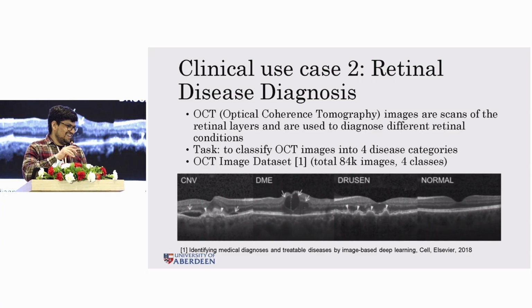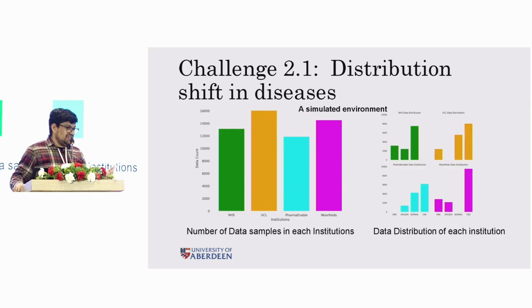Right. Okay, another thing that we work on is retinal disease diagnosis. OCT is an imaging technique for capturing the images. The task is, given these images, how we can predict one of, let's say, four categories, right? I'm taking this example as a reference, but this is the actual challenge, okay?